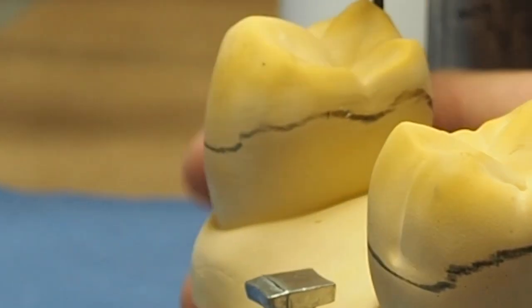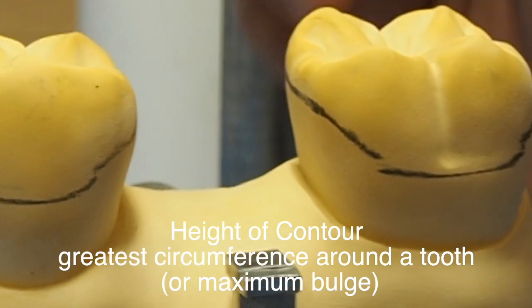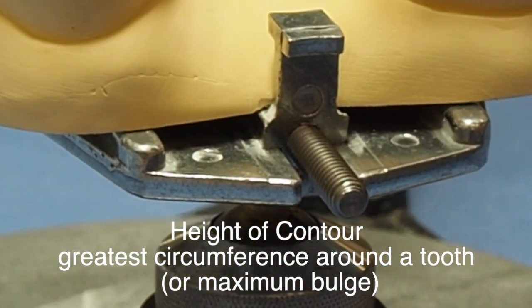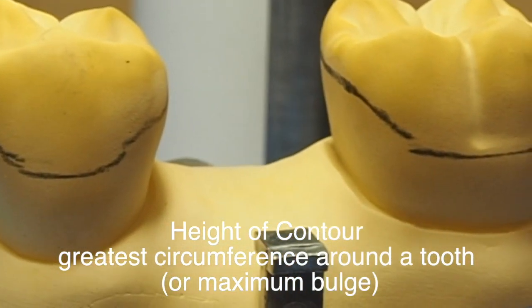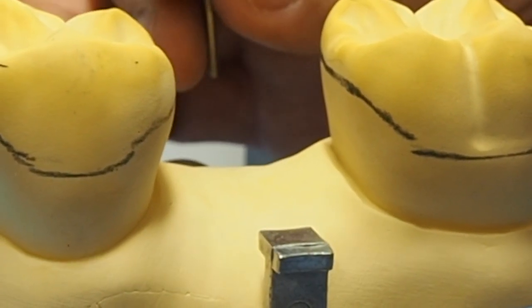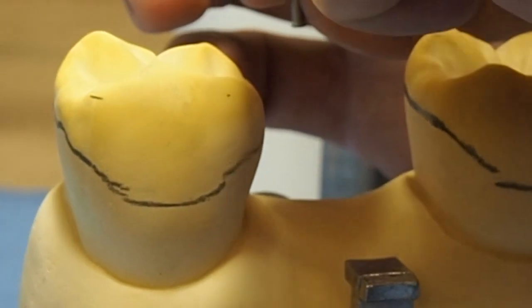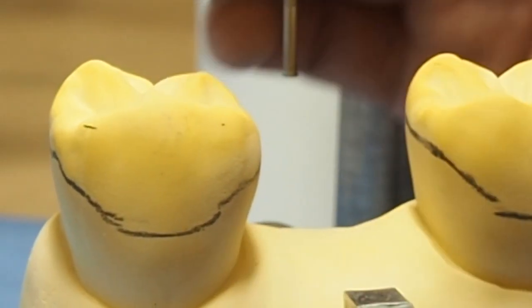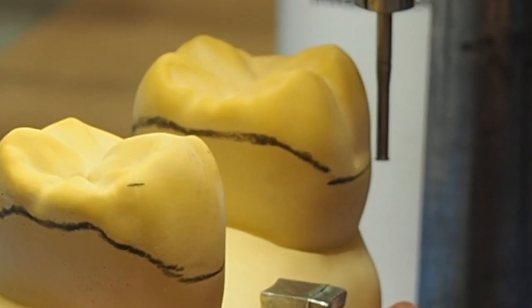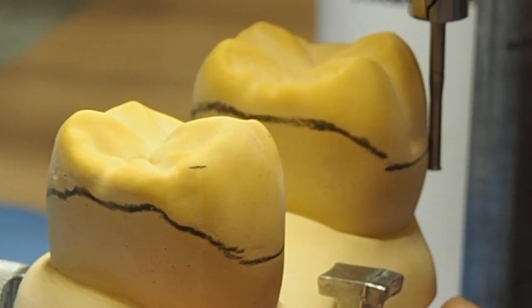Okay, now I think they define the height of contour as the greater circumference around the tooth that you have marked. I always have thought of it as the maximum bulge on a contour of the tooth. But later we're going to talk about superbulge and infrabulge. And infrabulge is where your undercuts are going to be, and superbulge, of course, is towards the occlusal surface or the incisal surface. Now he's putting on an undercut gauge, which we normally use a .010 for most clasps.